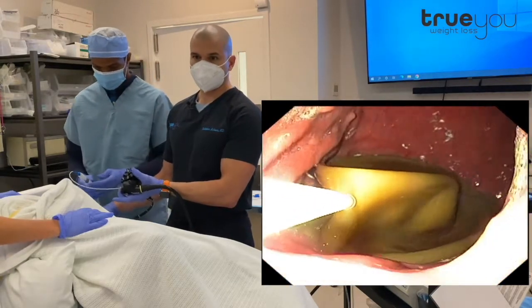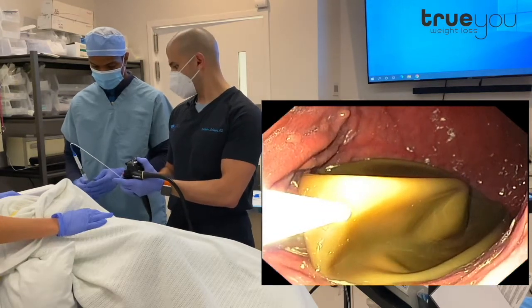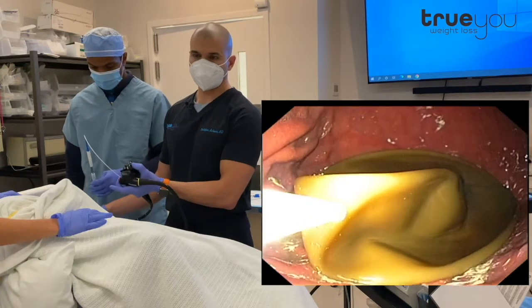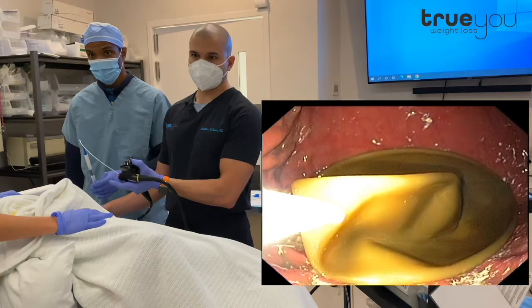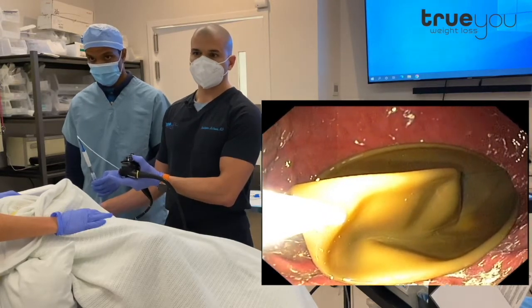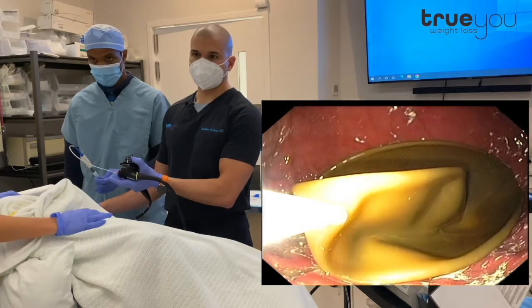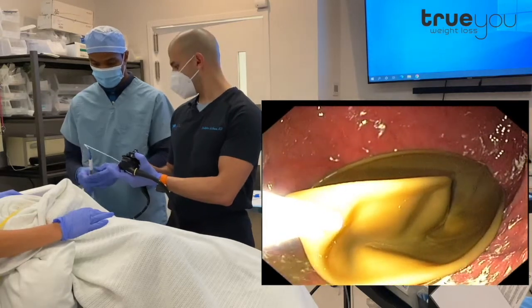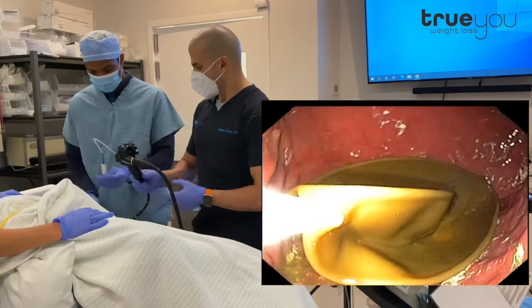A little tiny bit more here. And there it goes. We can see that balloon is completely empty, and we're going to disconnect the suction and then we'll drag it out. But the first thing we're going to do is actually lubricate the esophagus.